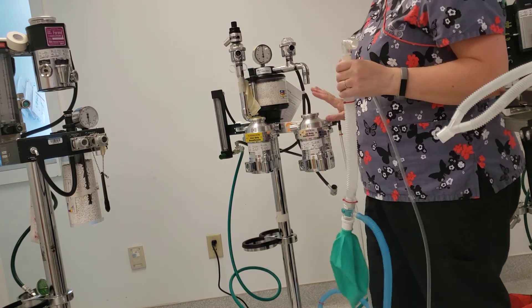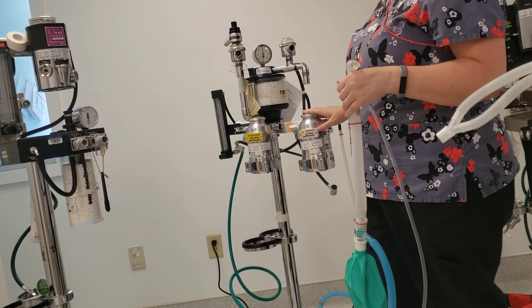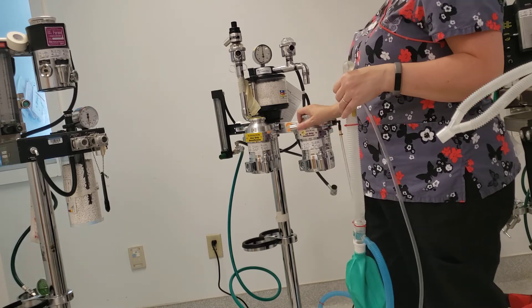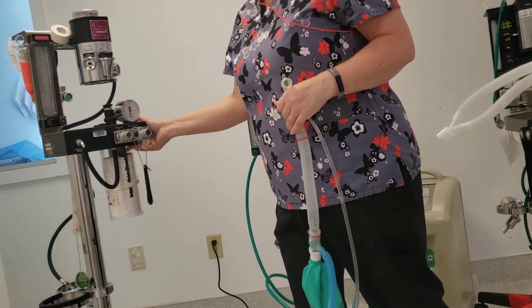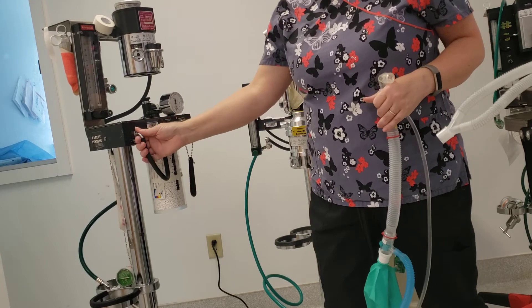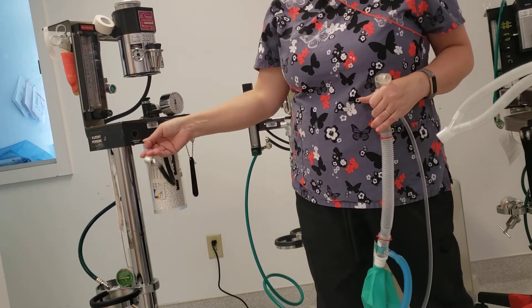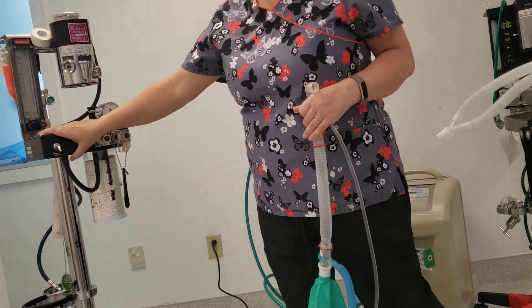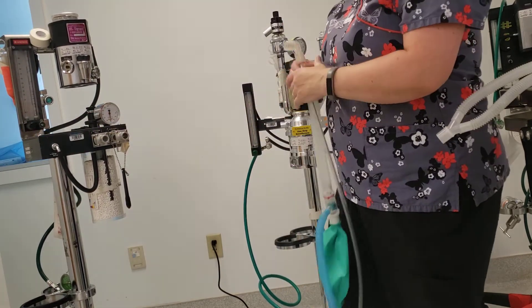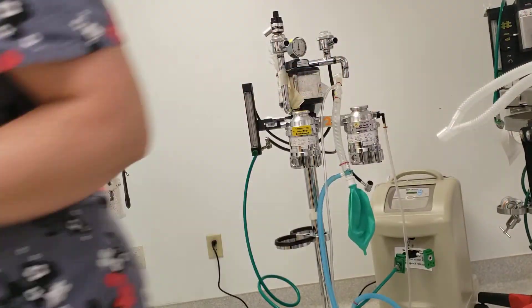Now you know how to hook up your non-rebreather to your anesthetic machines. There are some anesthetic machines that have an oxygen flush port, like this particular one, and some non-rebreathers will hook into this port right here. None of the machines at the school do that, so I just want you aware that you may come to clinics that actually have that type of system. So there's your non-rebreather and how to leak check it.